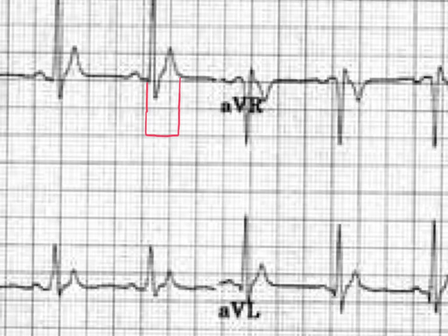Yeah, approximately 7 boxes. So what does that equal? 40 times 7. What's 4 times 7? 280 milliseconds. There we go, 280 milliseconds approximately. Is that short? Yeah, that's less than 350, right? We said about 350 is our cutoff, so this is shorter than that.